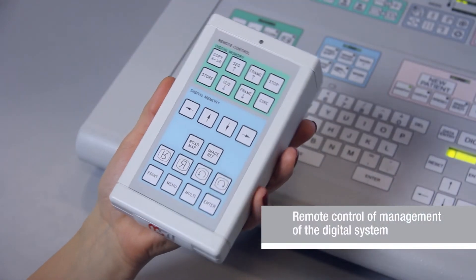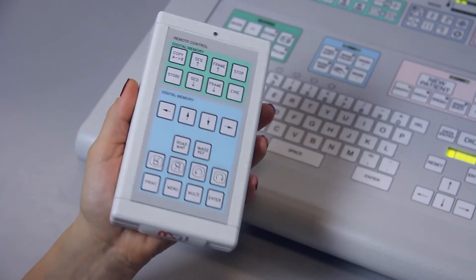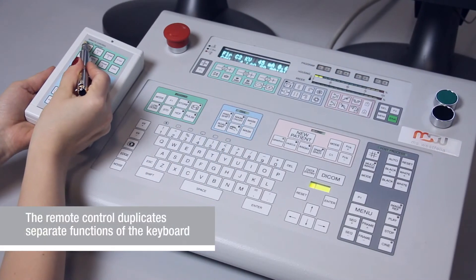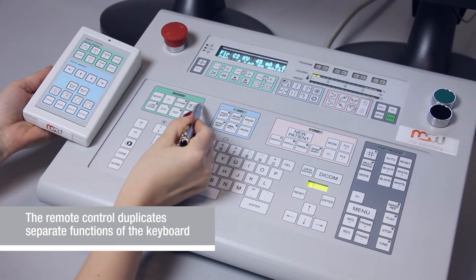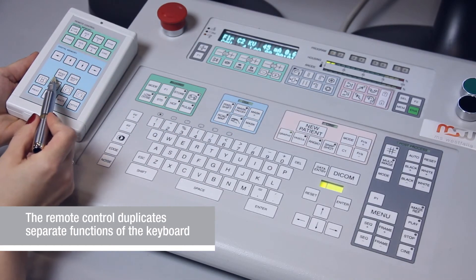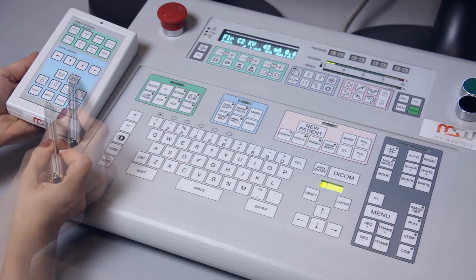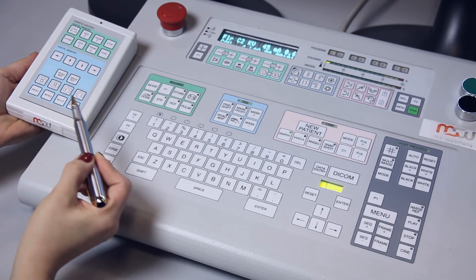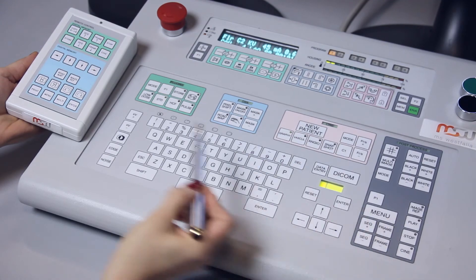The remote control of the digital system helps a surgeon or an assistant to work with images from any place in an operating room. Buttons for switching monitors, memory control, and main angiographic programs are synchronized on the panel. All database data may be displayed on the monitor.